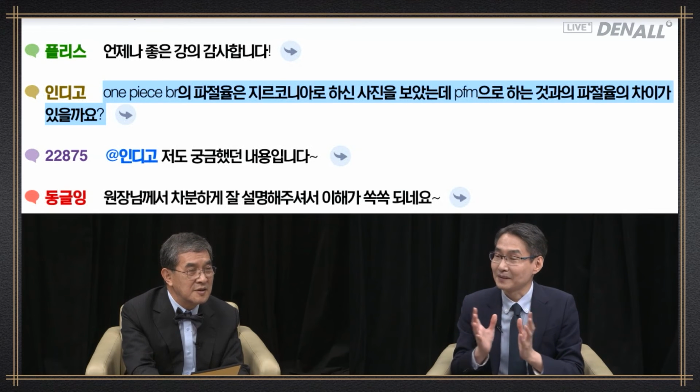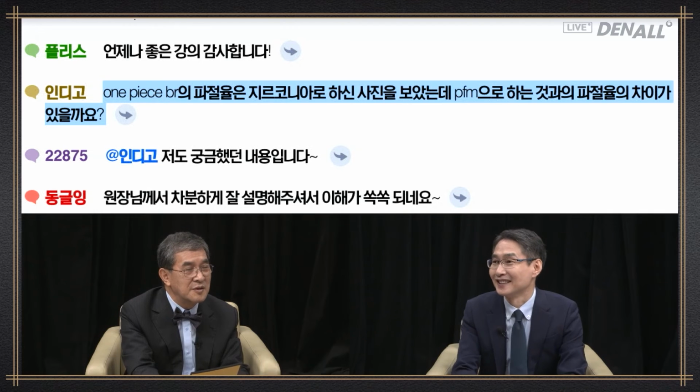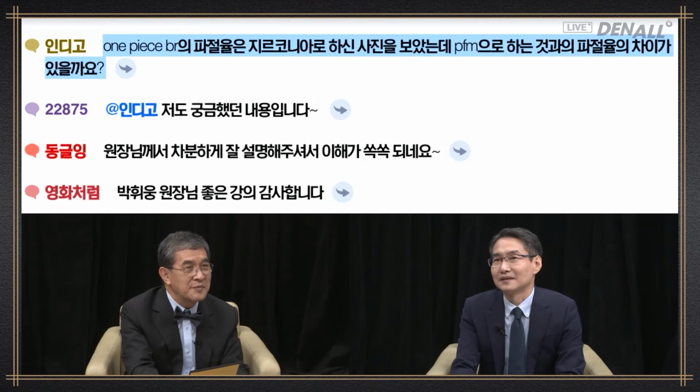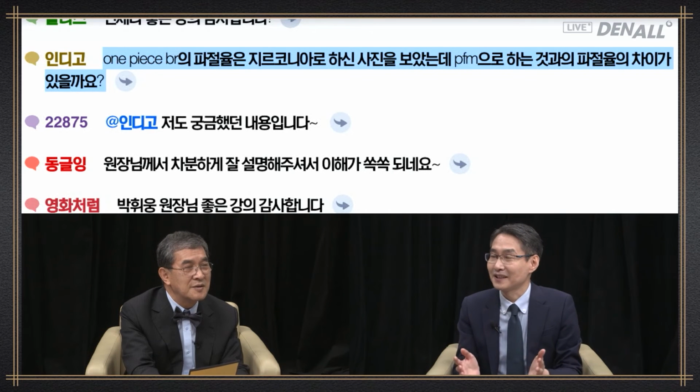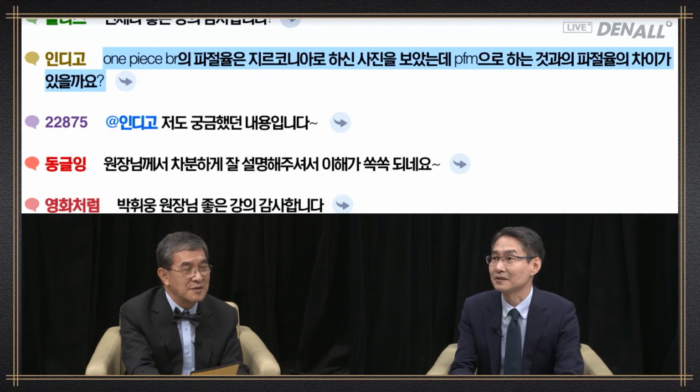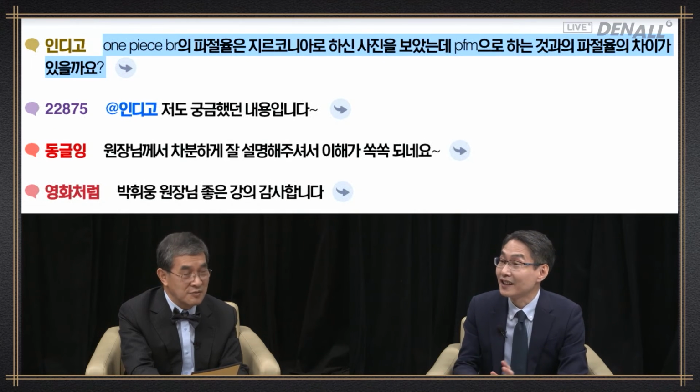However, ceramic facing or buildup often fractures. I've experienced this too much. After a couple of years, due to excessive chipping, only metal frame remains in severe cases. The prosthesis itself has not failed, but it's not aesthetic nor functional at all.